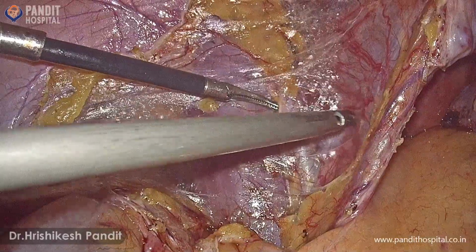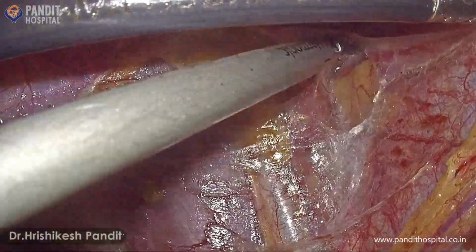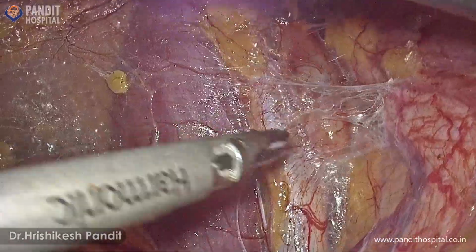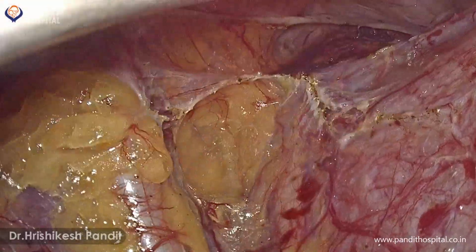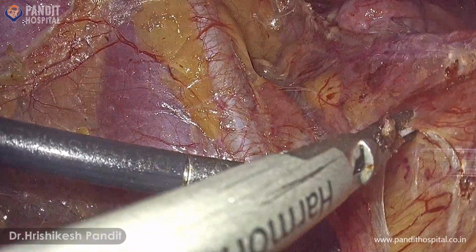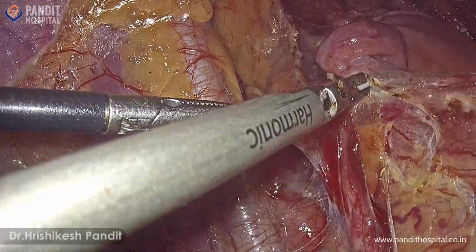We repeat the similar steps on the left side to open the retroperitoneum. First we dissect between the external iliac artery and the ureter. On the left side, the ureter crosses over the common iliac artery, whereas on the right side it crosses over the external iliac artery.